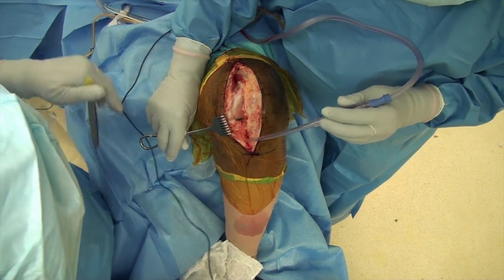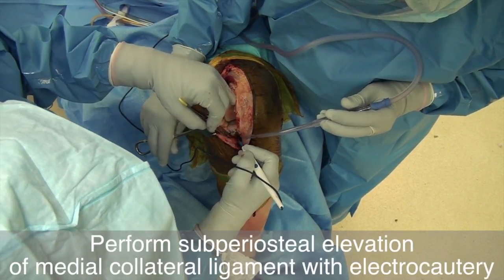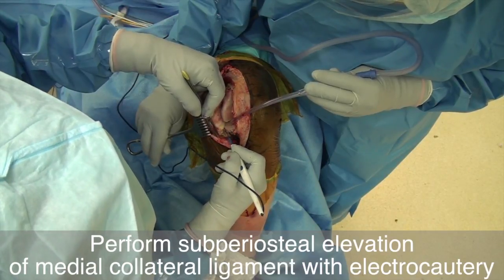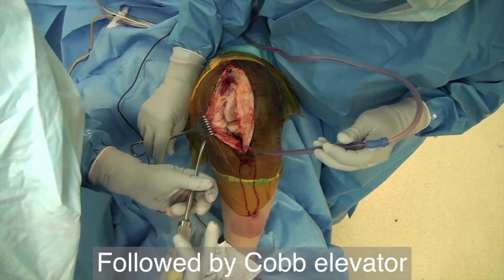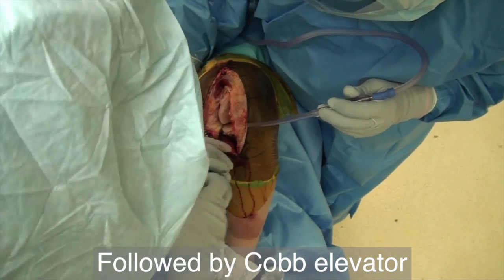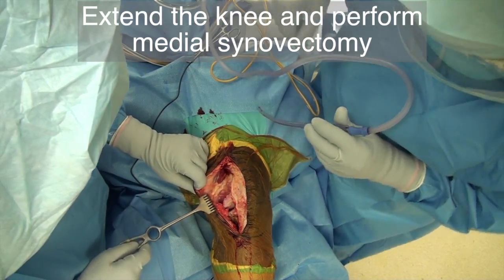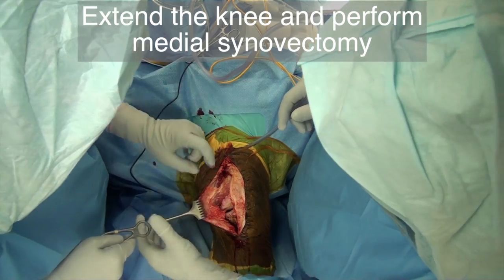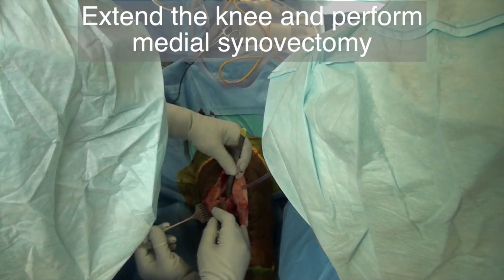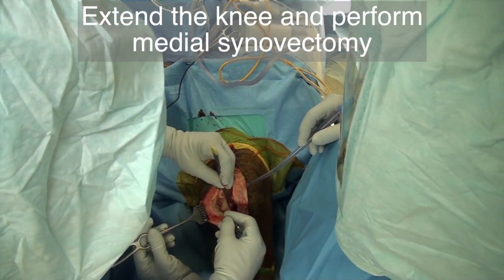Use electrocautery to perform subperiosteal elevation of the MCL. Use a cob elevator to complete the subperiosteal elevation. Extend the leg and reposition the rake retractor to expose the medial edge of the incised joint capsule. Remove the synovium from the medial aspect of the joint, trying to keep the excised synovium in one piece.